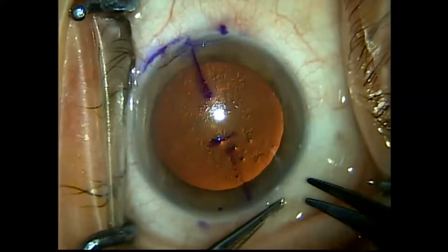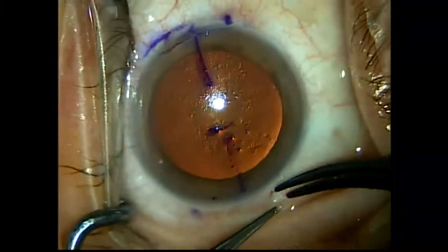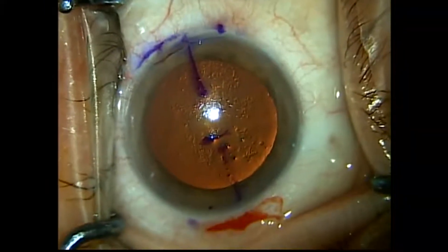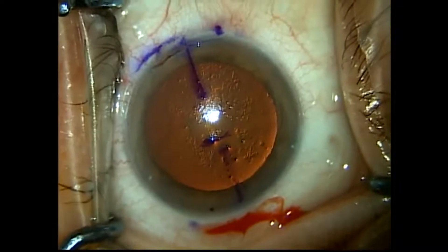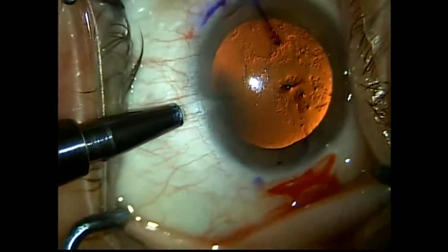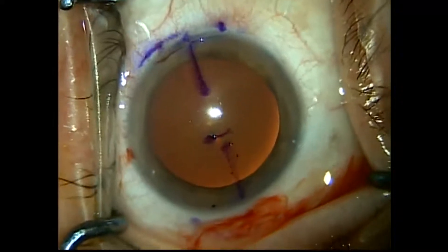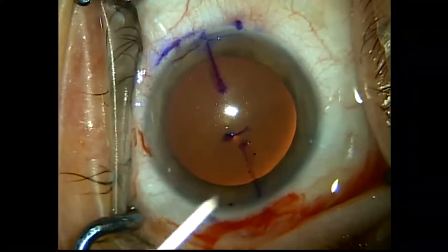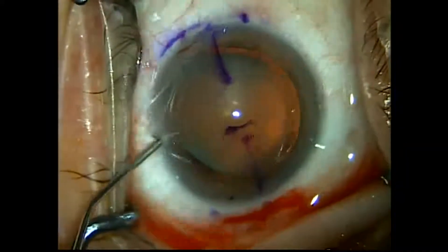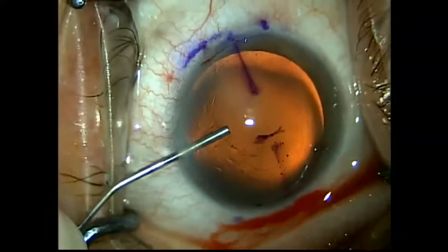For all crystal lens procedures I want the incision watertight. I still make a conjunctival peritomy and enter through the sclera on all crystal lenses. This gives me a greater chance of having a stable anterior chamber in the first 24 hours, because I do not want the crystal lens vaulting forward due to decreased intraocular pressure from a wound leak. I augment my anesthetic effect and moisten the cornea with OcuCoat, which also enhances visualization of the structures in the eye.